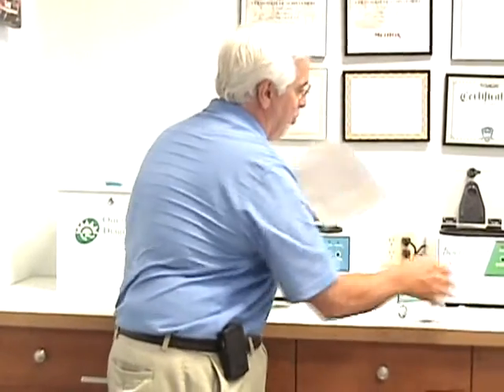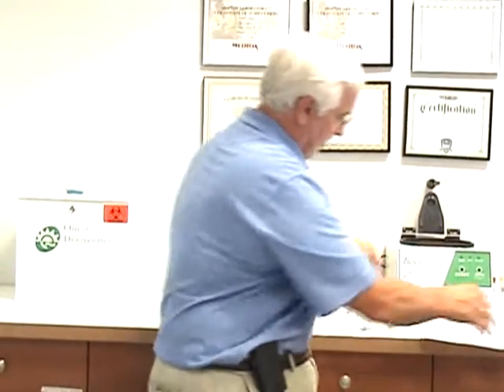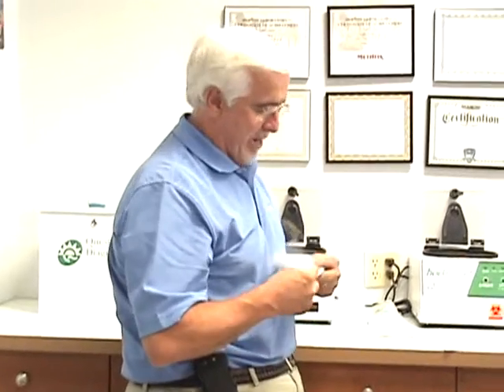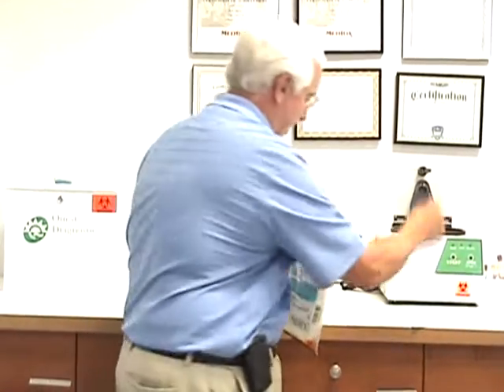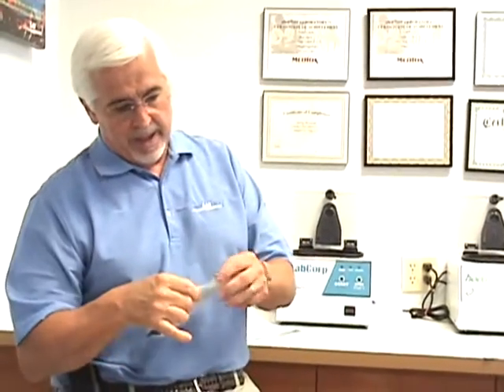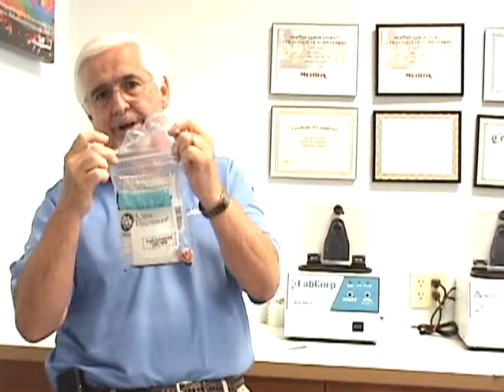At this point, the employee is going to have you fill out the section that says you watched all this. She's going to put the samples in the bag. She's going to take the proper page, fold it up, and put that in the bag. And then she's going to seal the bag. You should be very interested in making sure that you watch all of that. If you're not there when the bag is sealed, someone could mess with your urine and cause you a failed test that you don't need. And just like the two tubes I showed you, it's impossible to open that bag without showing that it got damaged. Okay?